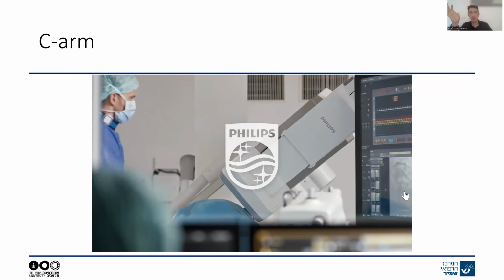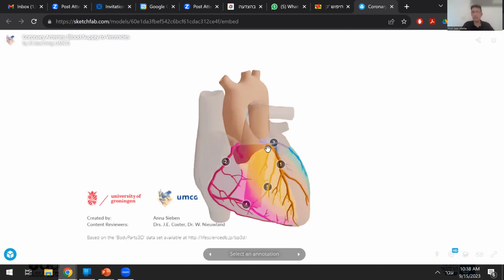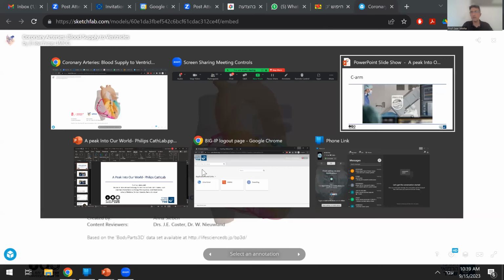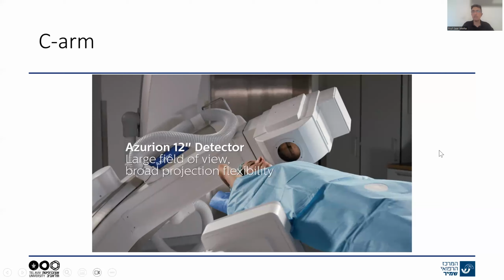So if I want to go from looking at this vessel as a long vessel, or as a C-shaped artery, to a line-shaped artery, the fact that the C-arm moves so fast really saves time. And again, it has detectors to prevent hitting the patient. You can see the hemodynamics on the screen. It's very, very flexible. It gives you the ability as a single operator to operate this whole show by yourself. Okay, so that's the C-arm.